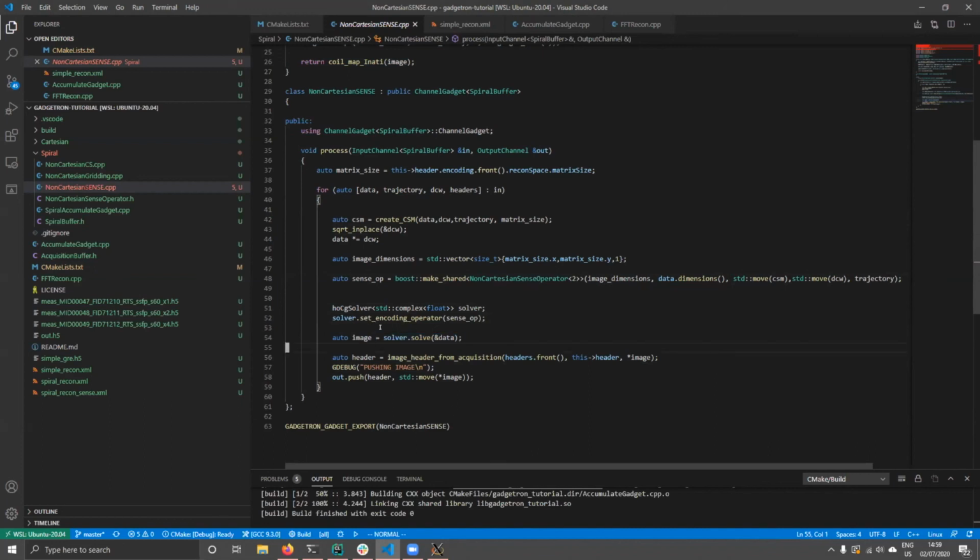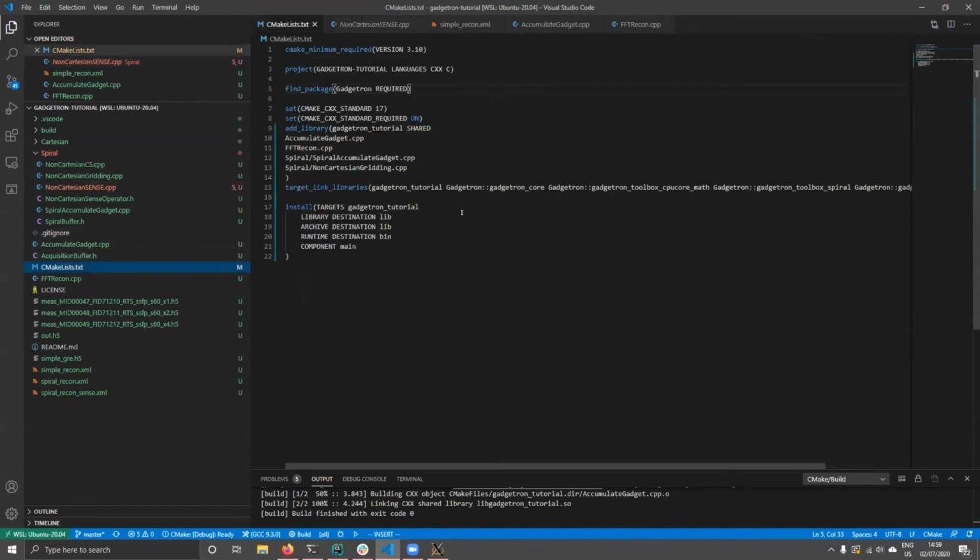So one thing to note here is that our image dimensions are different. This is just a 3-dimensional image. There are no coils because SENSE has built-in coil combination. We get our image header as before, and we are good to go. And I'm almost out of time.